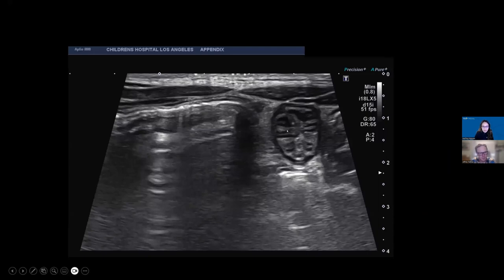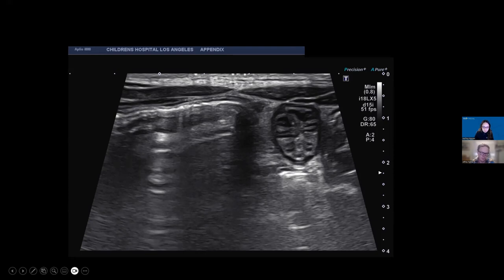For settings, we have Canon and I've optimized our bowel setting driving off of the appendix setting. I made it so the wall stands out more for small bowel. The large bowel has more gas, so you can only see the near surface of the bowel loop for that.